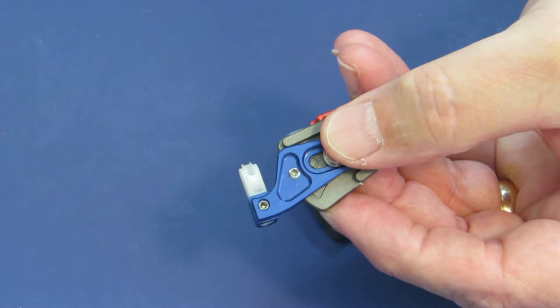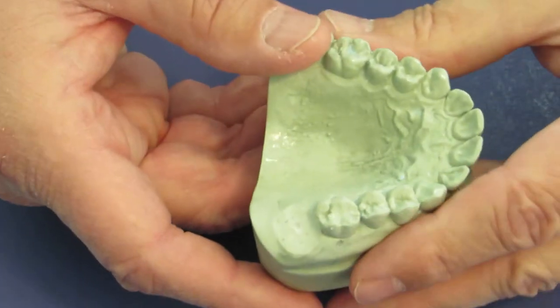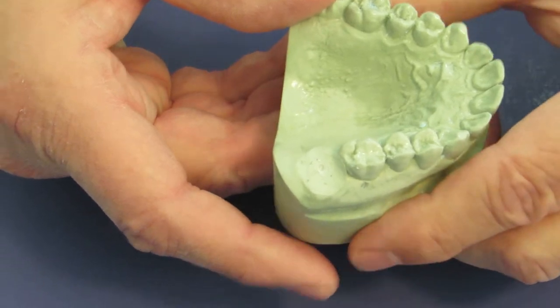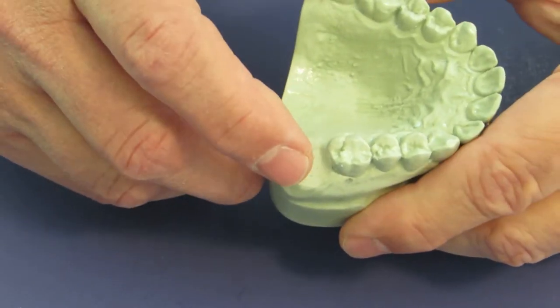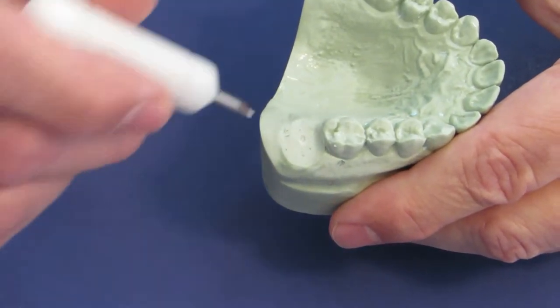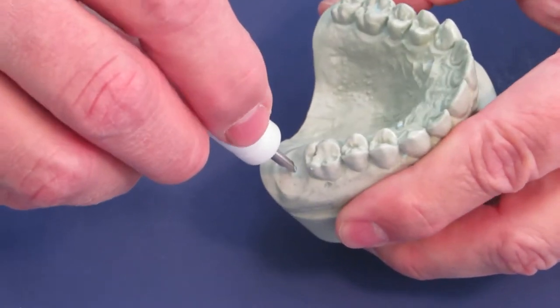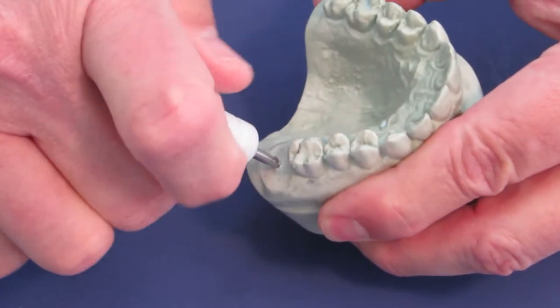So let me just show you how this works. We begin with our model, the model of where we would like to replace the tooth. And we make a small divot either with our handpiece or I have a hand drill right here that I can make a small divot.